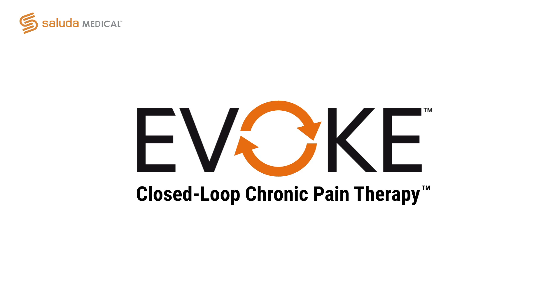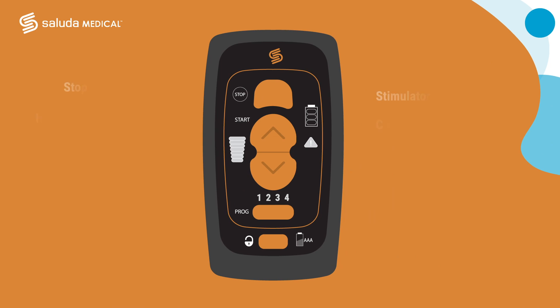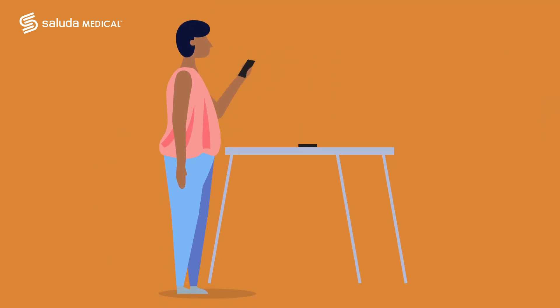This video is a short guide to help you use your Evoke pocket console, also called the remote, which will help you control your stimulator and your therapy. Let's begin by reviewing what each button on your remote will do for you. Before we begin, remember that the remote, or EPC, should be within three feet of your stimulator.